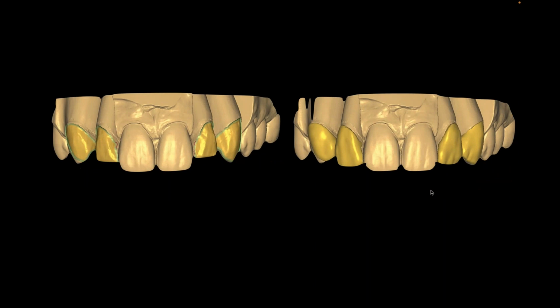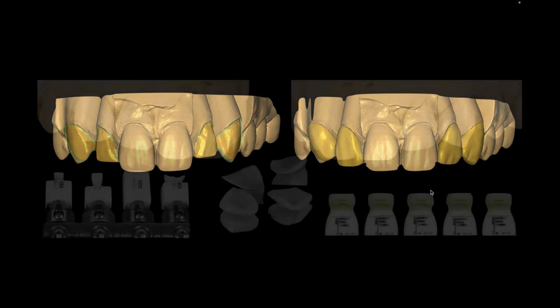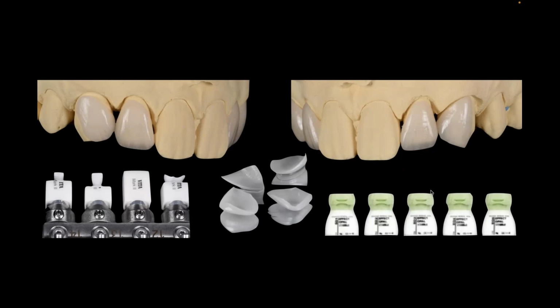So I designed these digitally, even though I had a physical impression. The impression was then scanned. I milled out my Mark II material, which is another VITA material. It's basically feldspathic ceramic, and it's fabulous. It's really one of my favorite materials because I have the ability to mill this very thin, as you can see how thin they are.